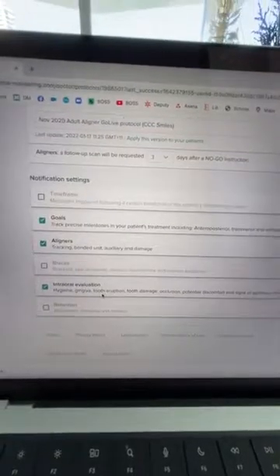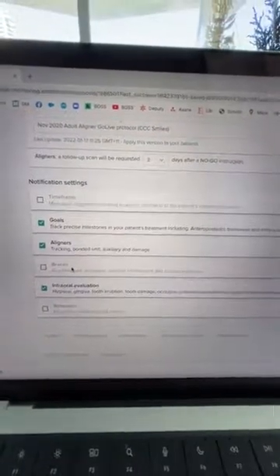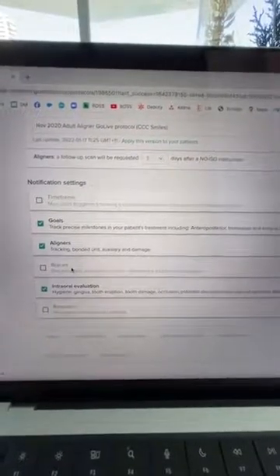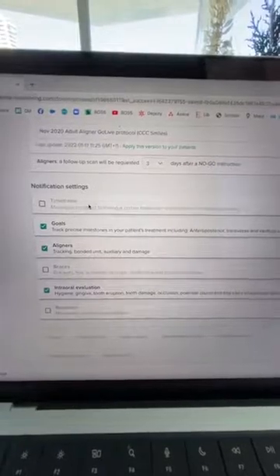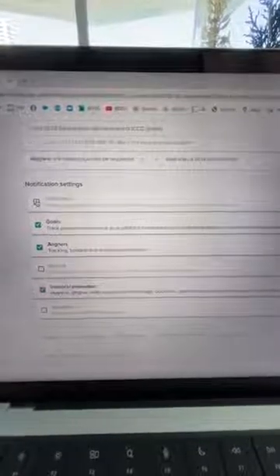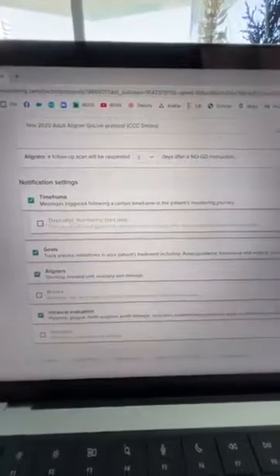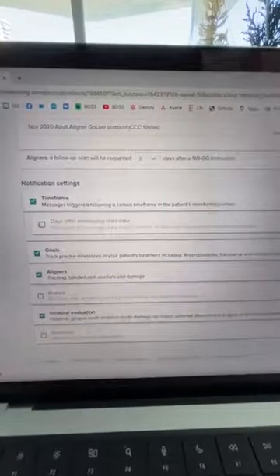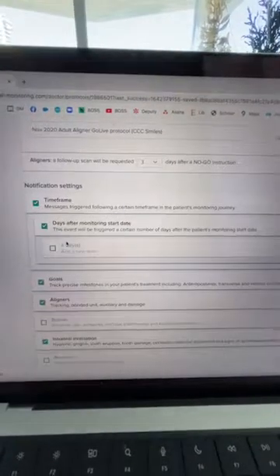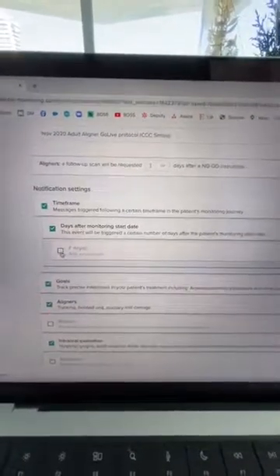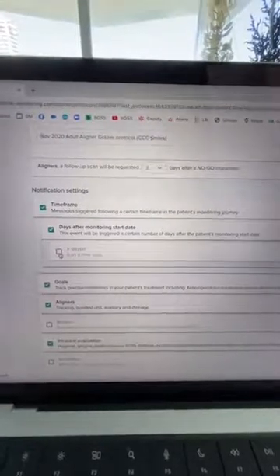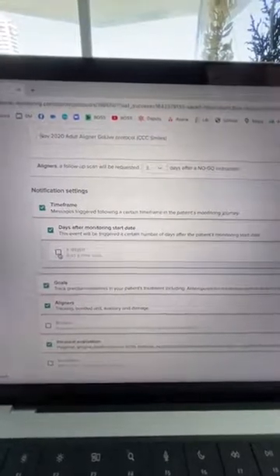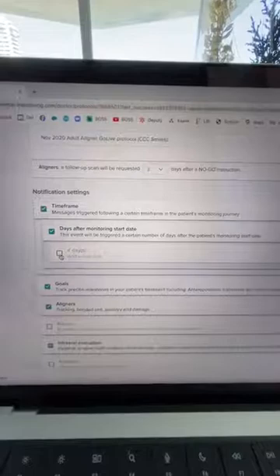We are tracking our certain goals, we're tracking our aligner fit, attachment debonding, we're tracking intraoral evaluation. Now we're not tracking braces because this is not a braces patient, and time frame also we're not tracking. For example, every 12 weeks you can send a patient an alert saying it's been six months now, you should go book an appointment with your dentist for a checkup and clean.